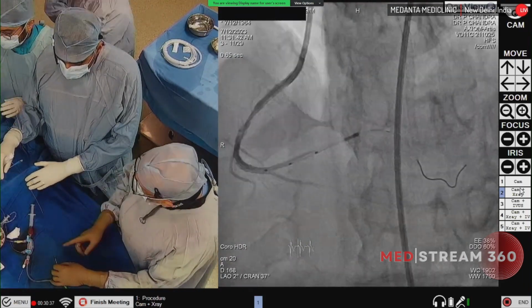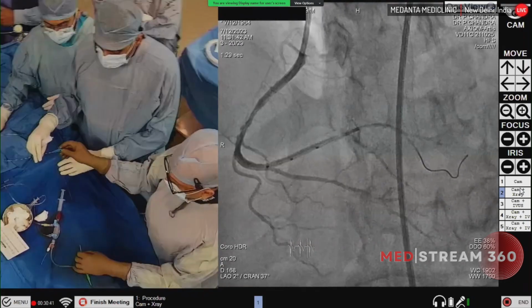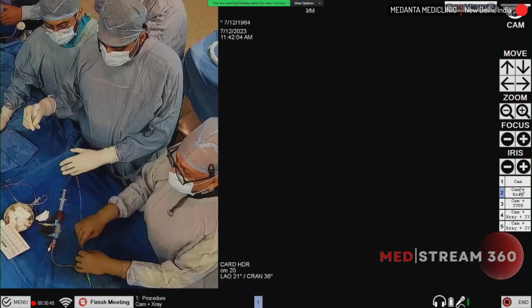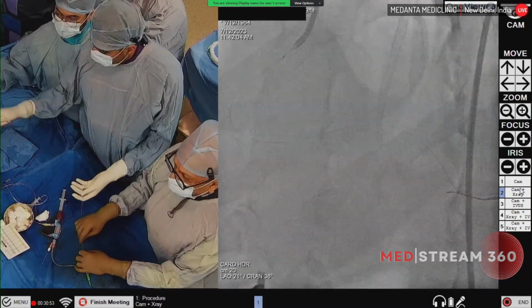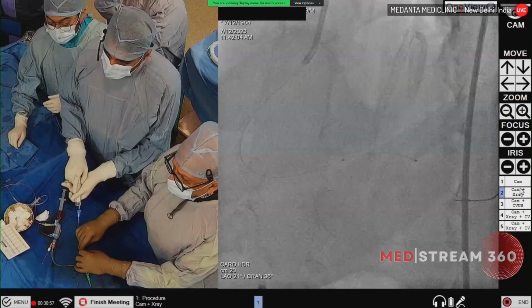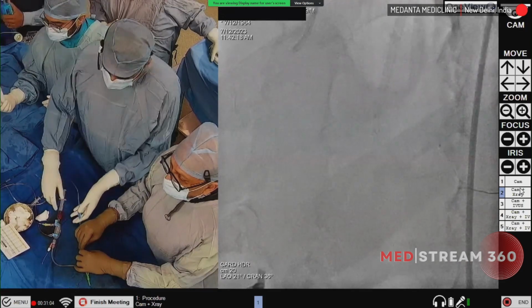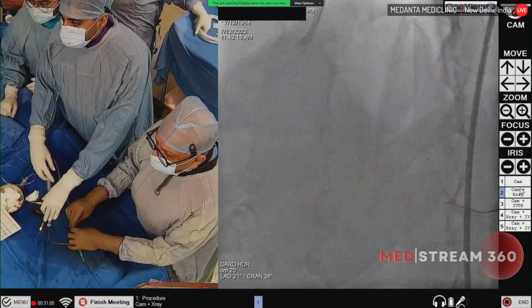So this is a 25 millimeter, and this is a 2.25, 25, and this is the solution which comes from Med-Alliance, and now it is a J&J balloon. So there's a drug-eluting balloon which has release kinetics that are slightly different because the drug is in some kind of globules what they have made, and the balloon is wrapped in a proper way. Check, please. Okay, I can go a little bit further.